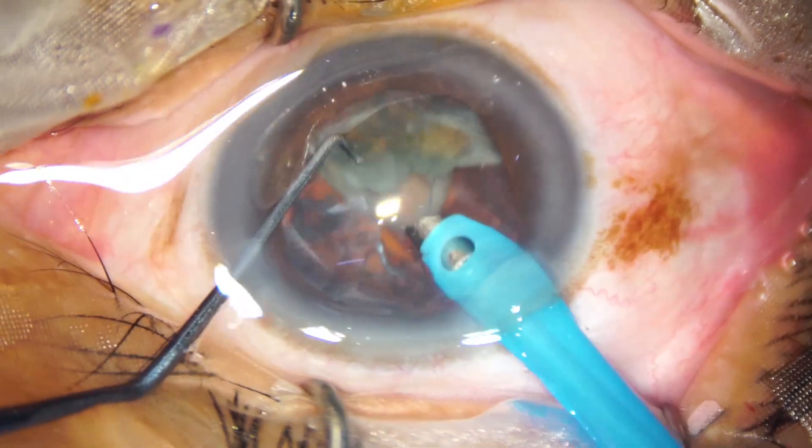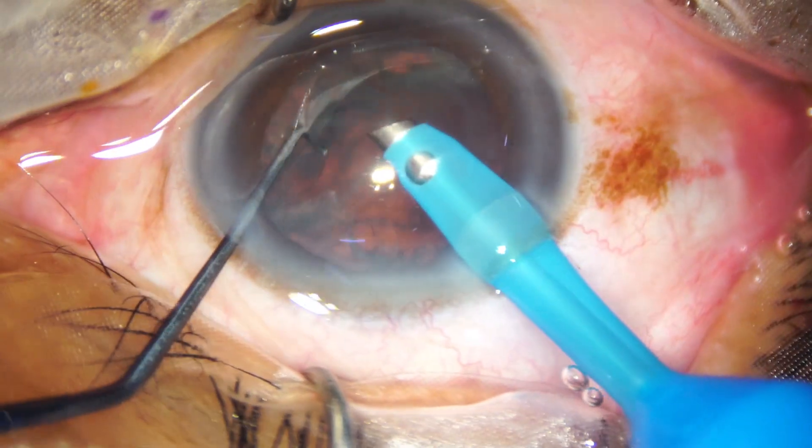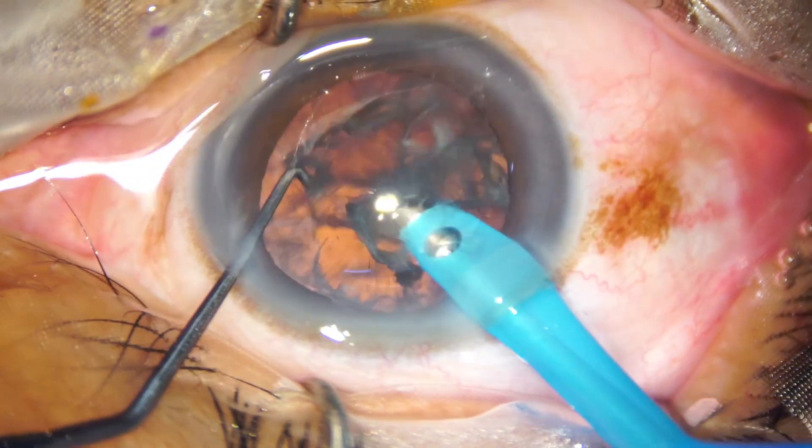Almost done. This is the last nuclear piece. See the epinuclear shell — it is protecting the posterior capsule.